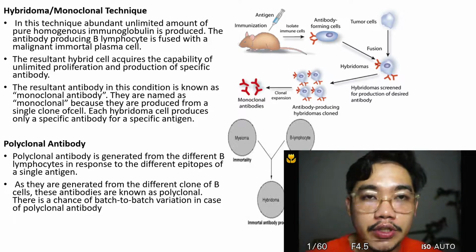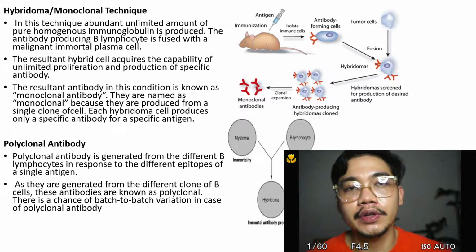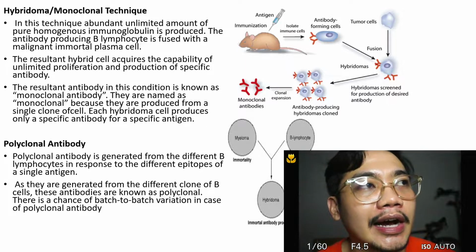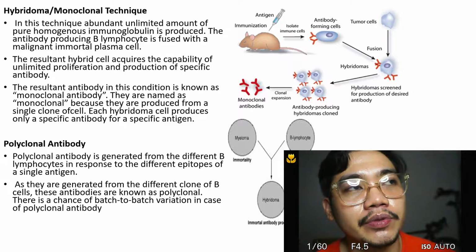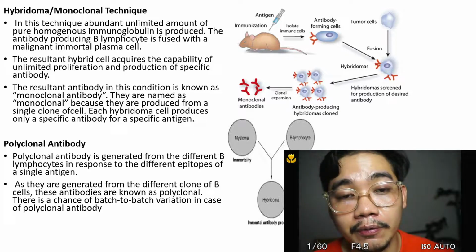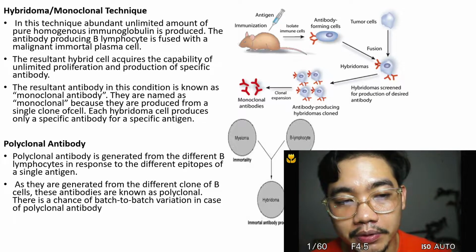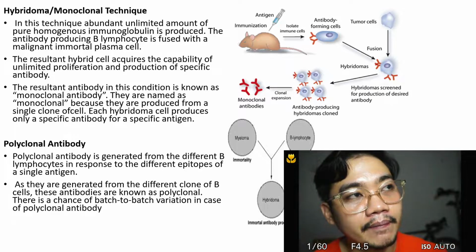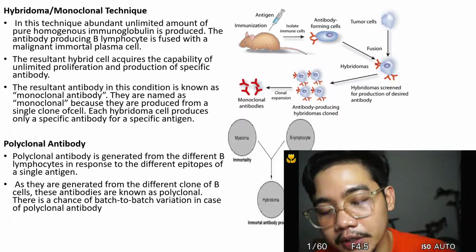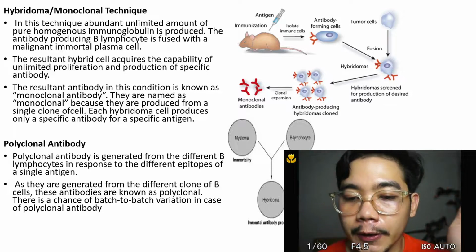The estrogen receptor is also positive in your normal endometrium. It's the same receptor you can see in breast cancer that is estrogen receptor positive. It's the same receptor but in a different location: pathogenic in your breast mass, but physiologic in your endometrium.